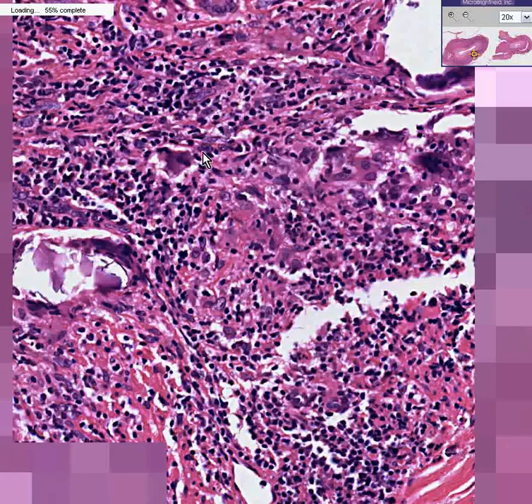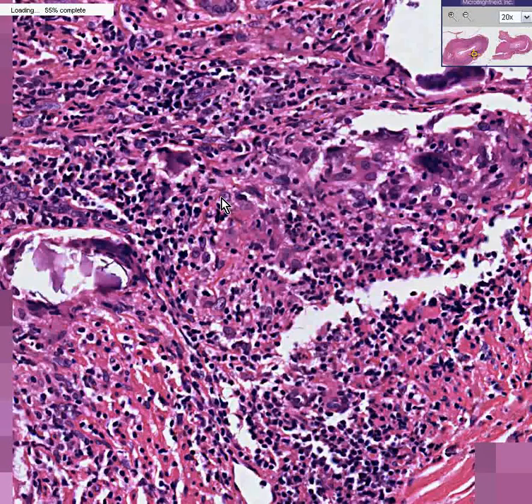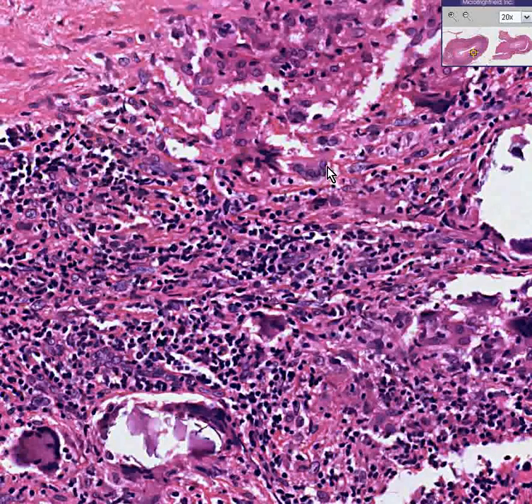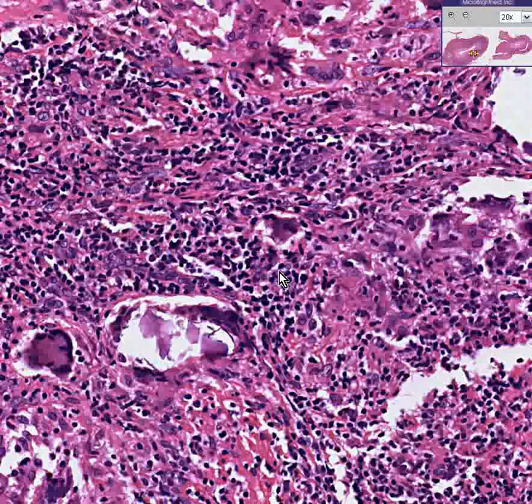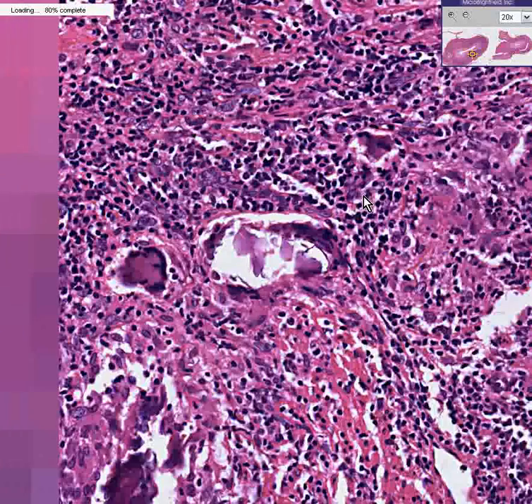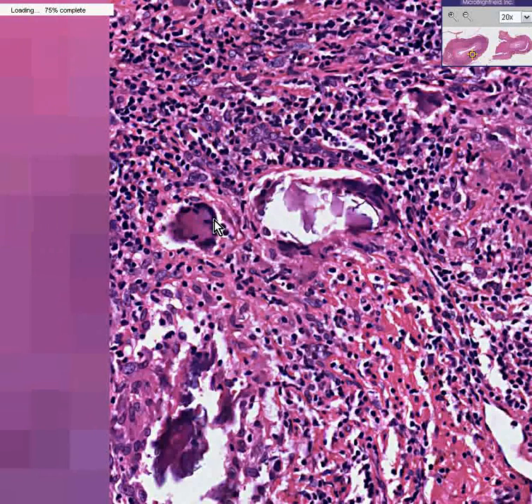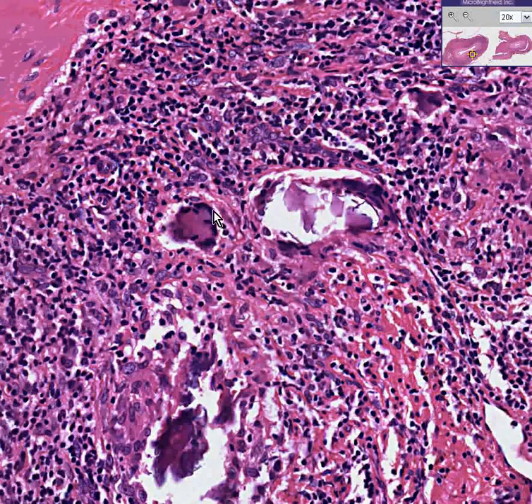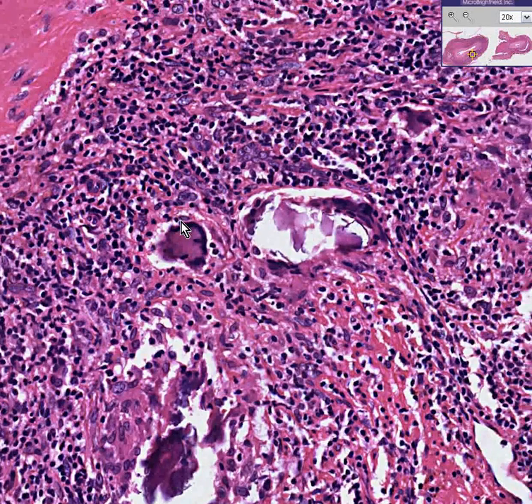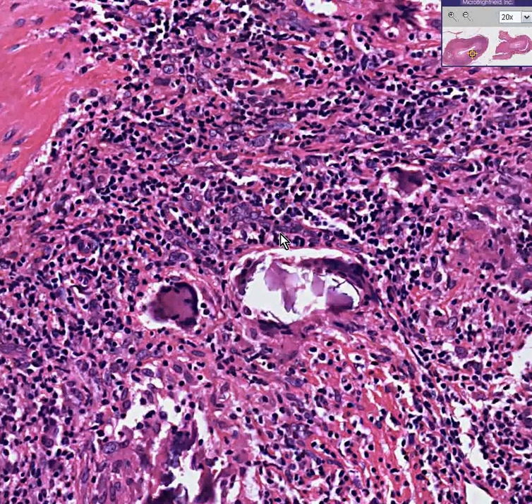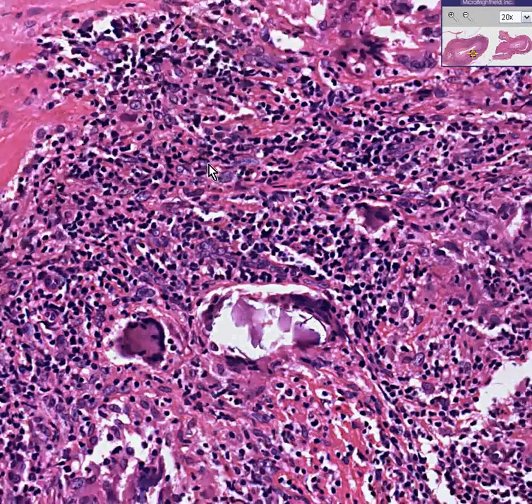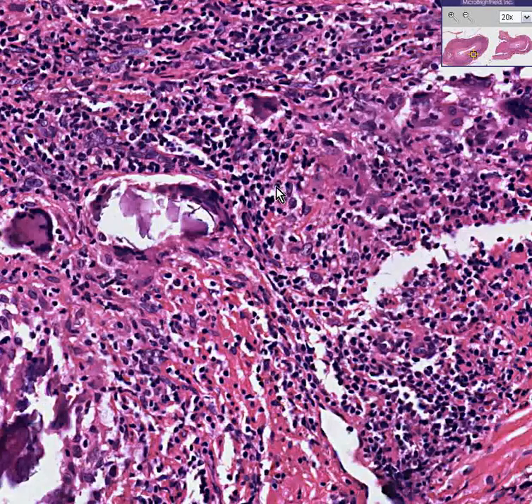You see the classical multinucleated giant cells. Here's a giant cell with multiple nuclei, and here's another giant cell with multiple nuclei peripherally arranged — just like you see with granulomas of TB and other conditions.